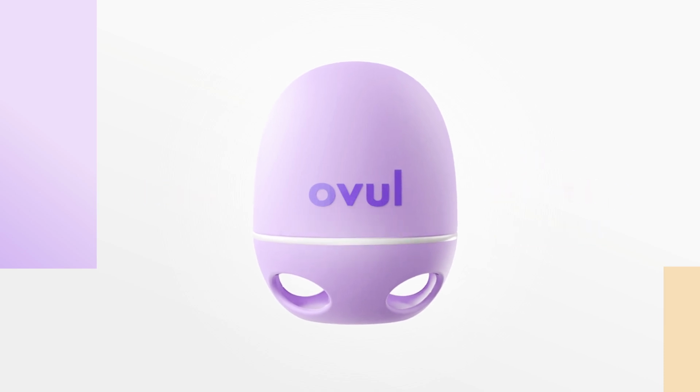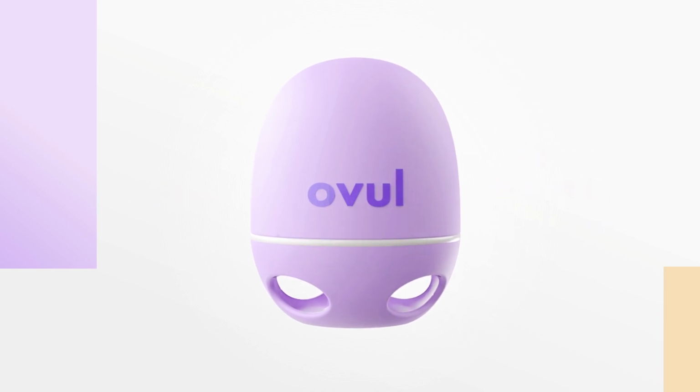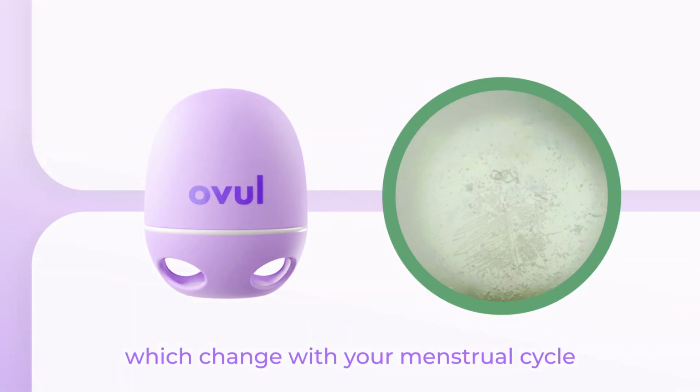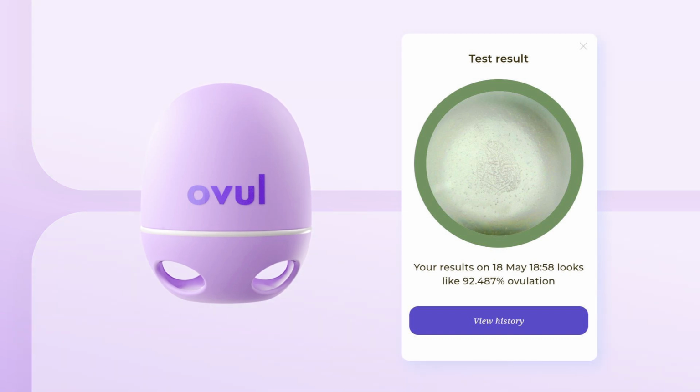A simple, scientifically backed method that turns your daily health tracking into a quick and enjoyable moment. How it works. Ovul analyzes your saliva for crystallization patterns, which change with your menstrual cycle, and helps you to track ovulation.